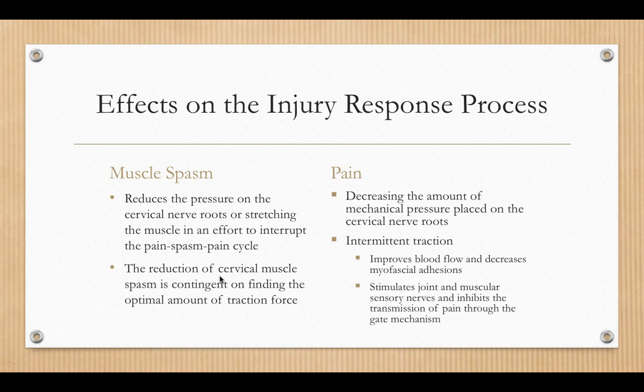So the first treatment, they might not get the results that we would expect, because we need to add a little bit of distraction, of tension, or we maybe need less. So it's a little bit of trial and error to really get the optimal amount for this particular patient. And also the positioning of the body plays a big role in that too. Are we really targeting that muscle that's in spasm?